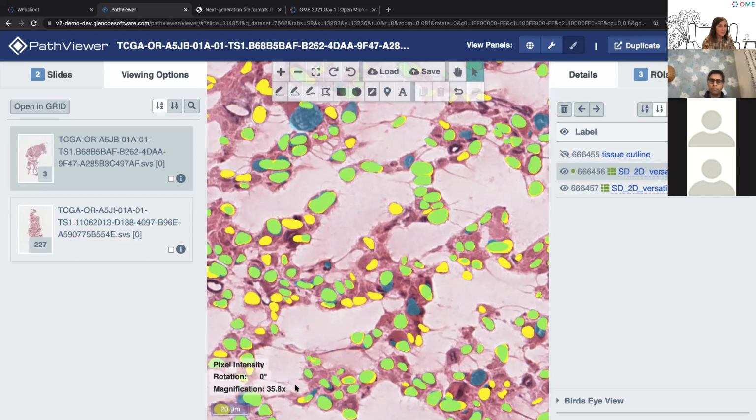But a 3D representation, I think in some imaging domains, is even more valuable. And how exactly you would represent that in a particular viewer, I think there's some room for other input there. This is really designed first and foremost for planar viewing. But the underlying data model is very compatible with 3D data, yeah.